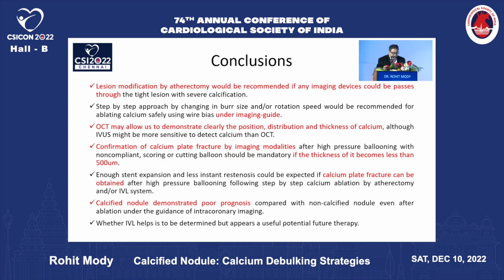And finally, the calcified nodule demonstrated a poor prognosis compared to non-calcified nodule, even after ablation under the guidance of intracoronary imaging. Whether IVL helps is to be determined, but it appears a useful potential future therapy. Thank you very much.